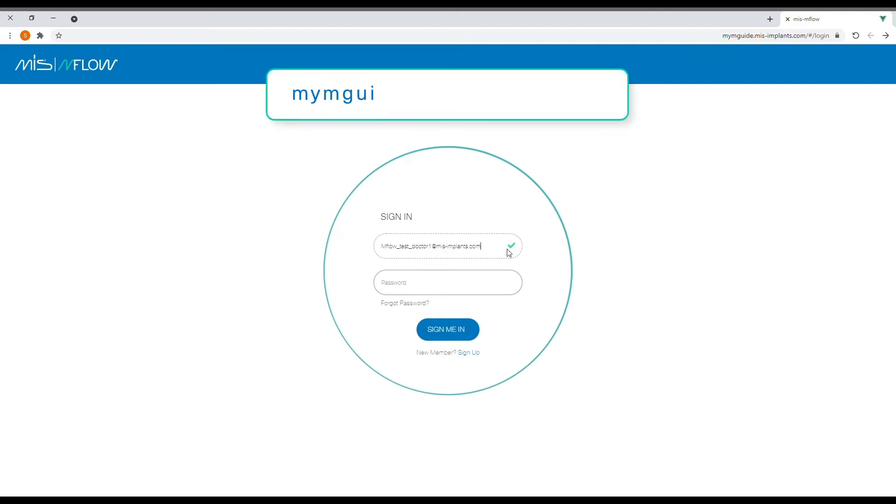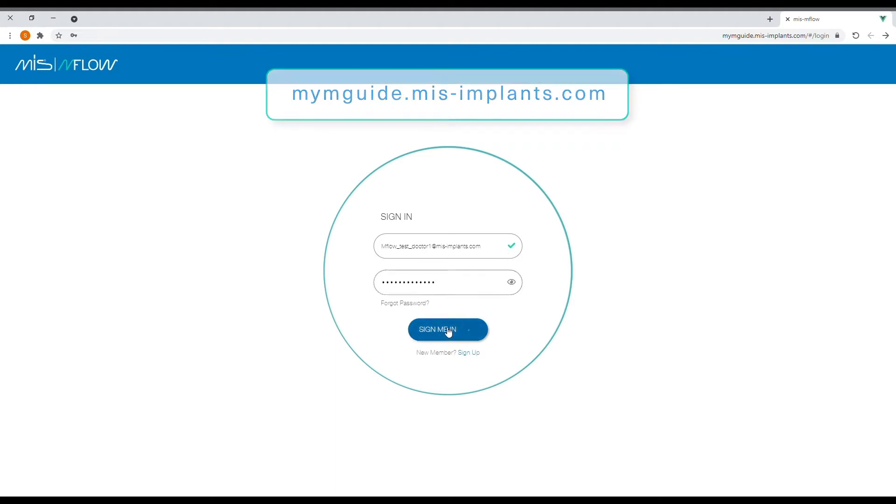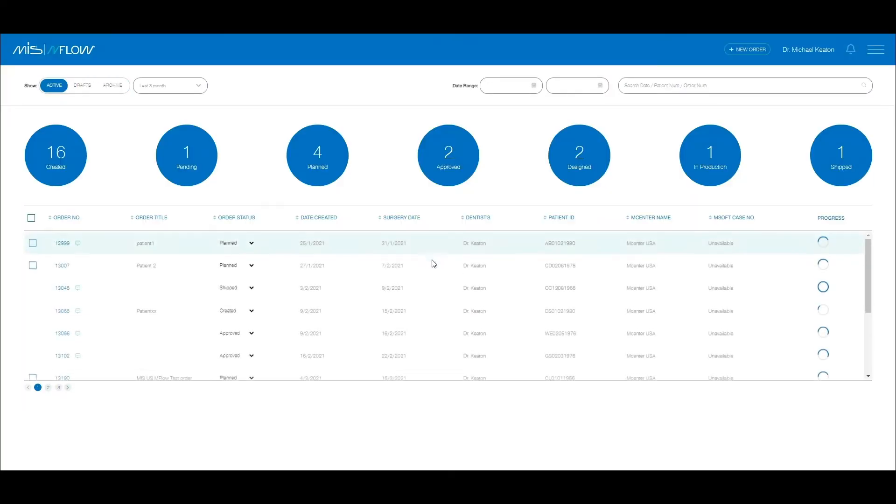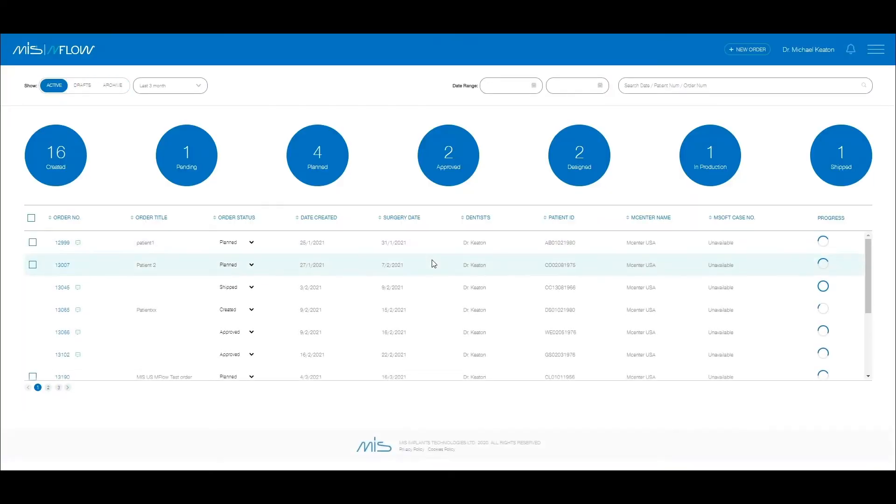After logging into mymguide.mis-implants.com with your email and password, you will get to your home page. Your home page is where all of your existing order information may be found.